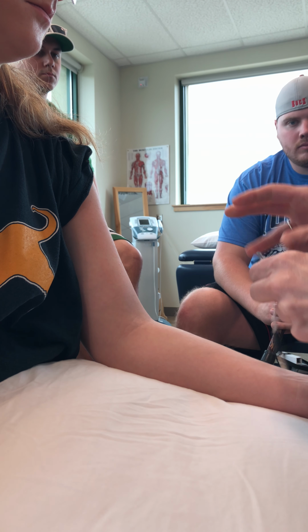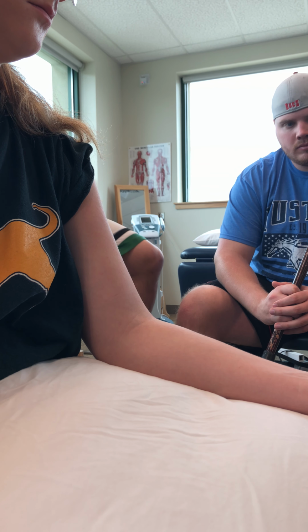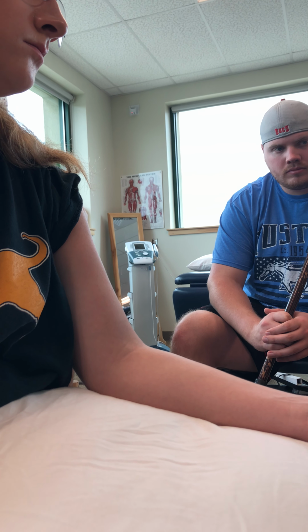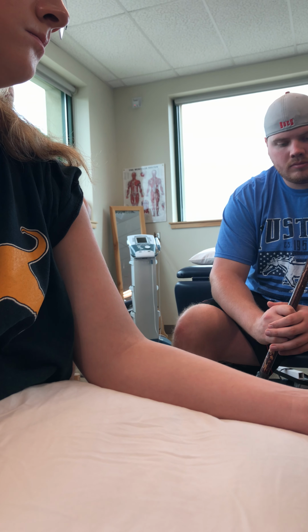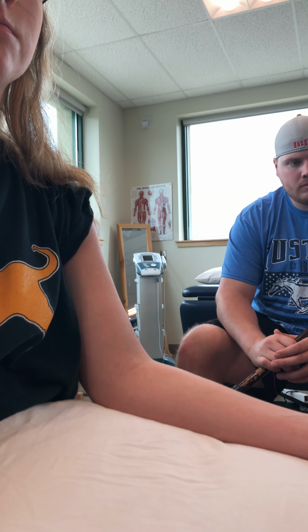And then you would do the skin check at the end. Can you feel me touching you? They're usually a little bit pink, and that's normal because it increased circulation. Usually with this stuff, in 30 to 60 minutes, if you get any pinkness, it should go away. That's normal. 30 to 60, that's actually in your PowerPoint, I believe.